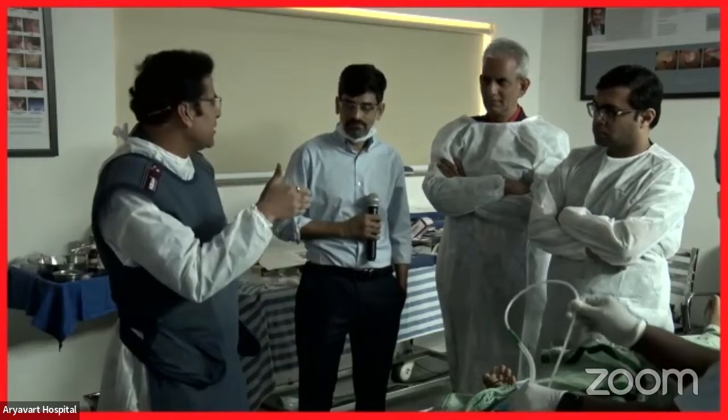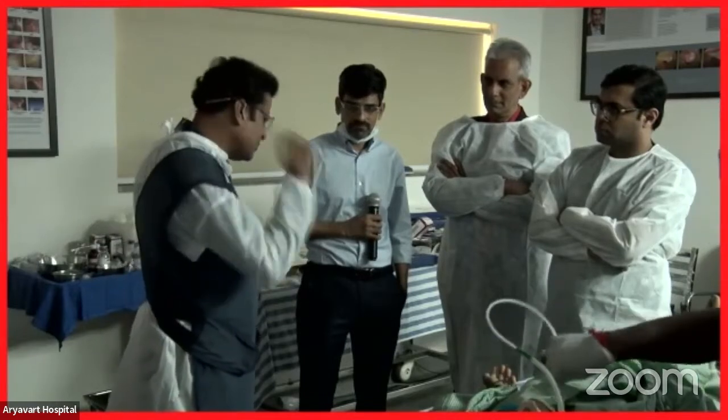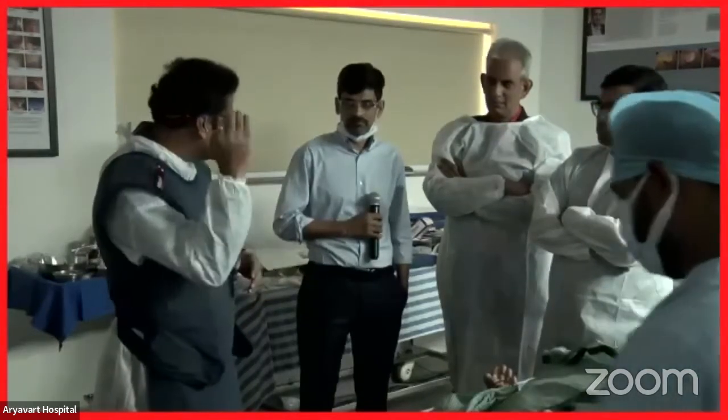Yeah, it's again simple logic. This is not an FNA, where you go and jab. What you are trying to do is cut. You are cutting the stomach as well as the small bowel, so it has to be a gentle movement, not a jab. If you jab, the bowel will obviously push off. The second thing is using a wire, which I think destroys the whole thing. So it should be without wire, and a smooth negotiation of the catheter into the small bowel.